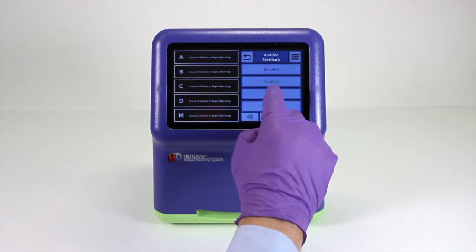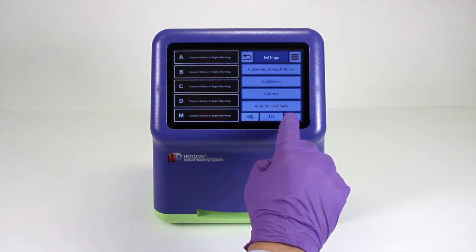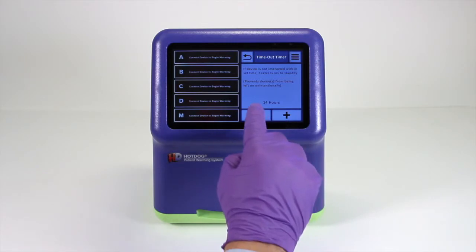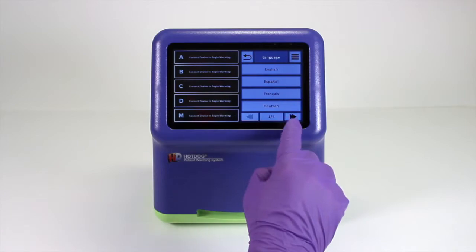If the audible feedback feature is engaged, you hear a short noise every time you touch the screen. This controller also has an automatic shutoff feature that is preset to six hours of non-interaction. However, if your surgery requires a longer period of time, this too can be adjusted.